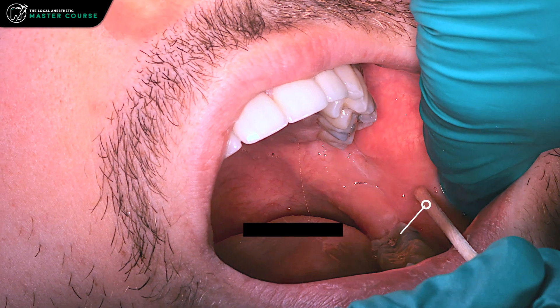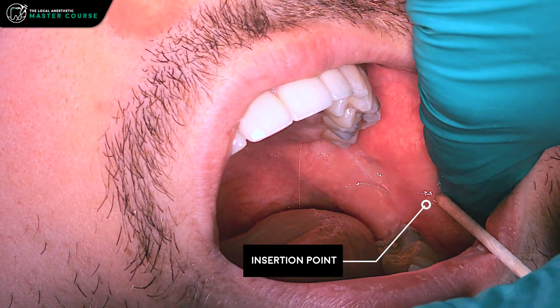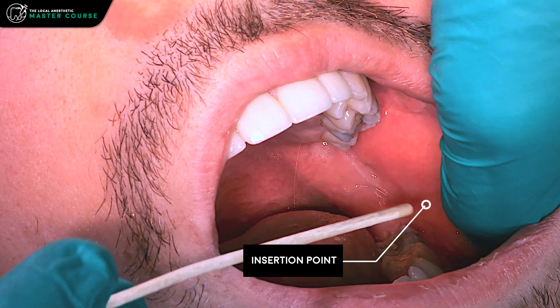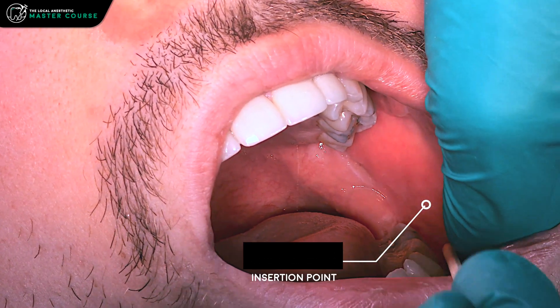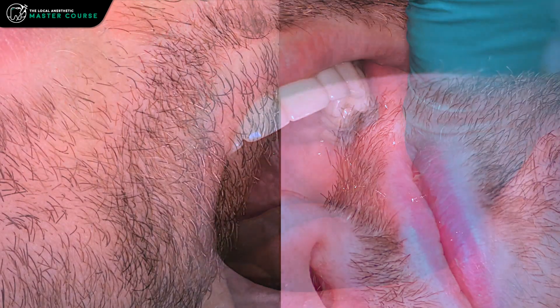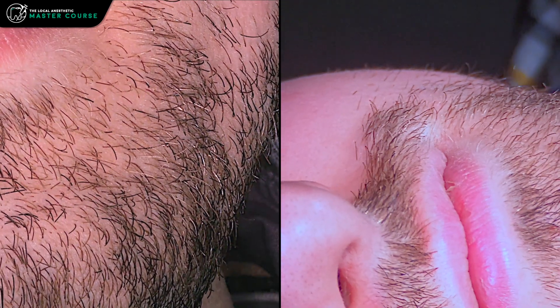You're going to catch that buccal nerve as it's branching down out into the tissues. That's going to numb everything right down along that vestibule and along the molars for that buccal gingiva. When we're doing the buccal nerve block, we're usually accompanying the inferior alveolar nerve block.